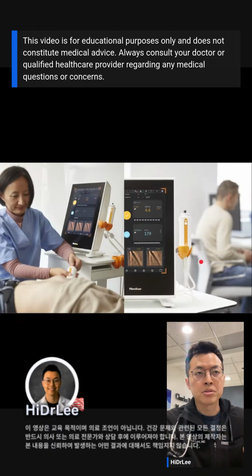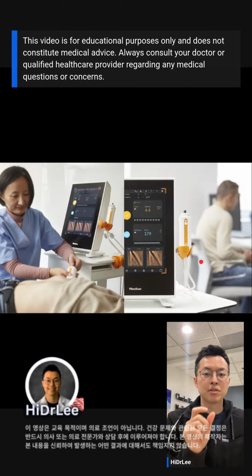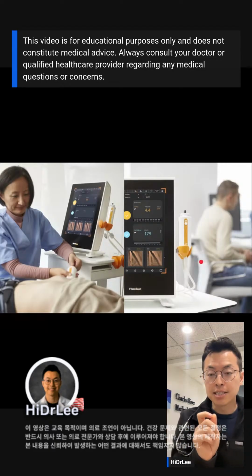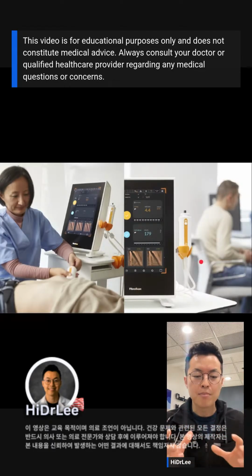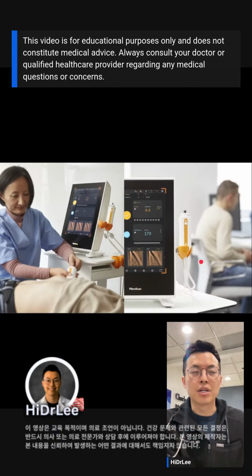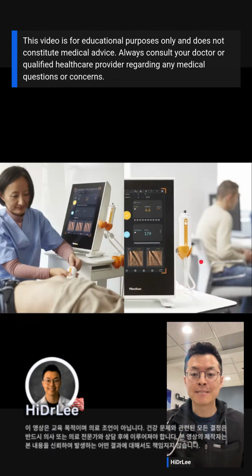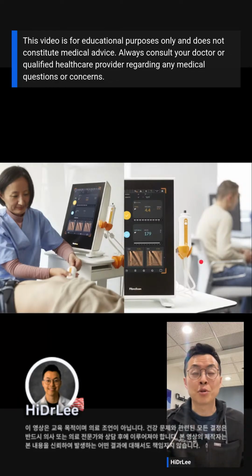And more importantly, we call it Fibroscan because it tells you how much fibrosis is in the liver. When inflammation or damage is repeated or continues in the liver, it may cause scar tissue inside the liver, fibrosis. The most advanced form of fibrosis is cirrhosis. Cirrhosis is a condition that many people die of.